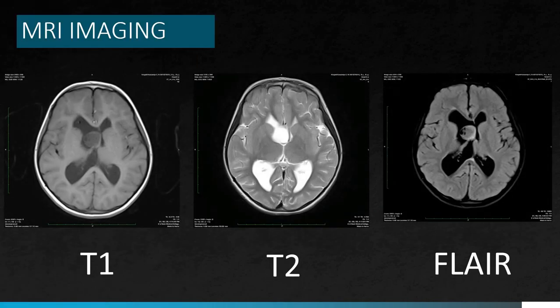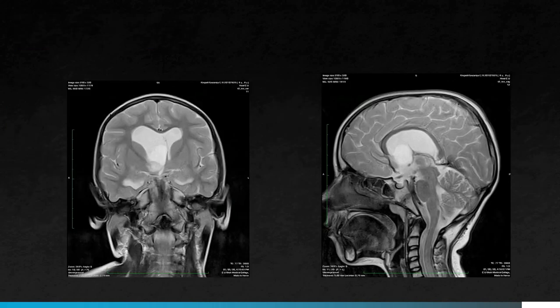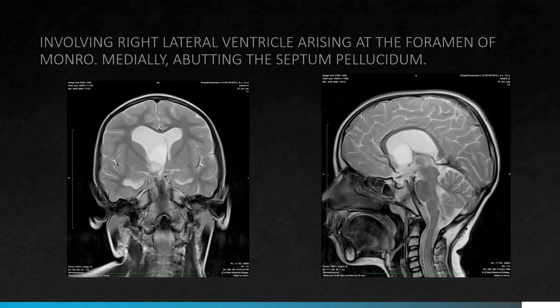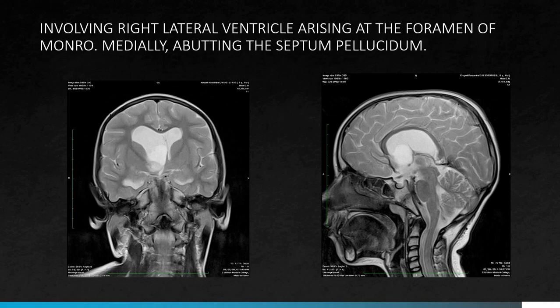MRI brain study revealed an altered signal intensity lesion in the right lateral ventricle which appeared hypo-intense on T1 weighted images, hyper-intense on T2 weighted images, and hypo-intense on FLAIR images. On coronal image, we can see that the lesion is involving the right lateral ventricle arising at the foramen of Monroe.